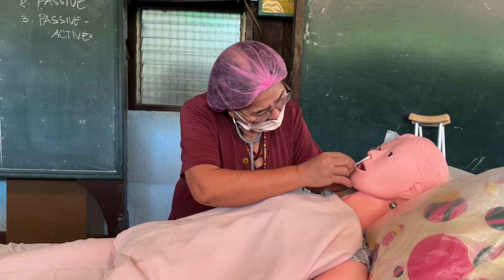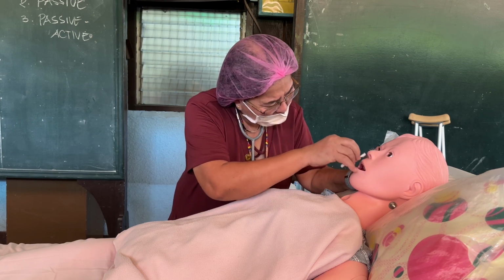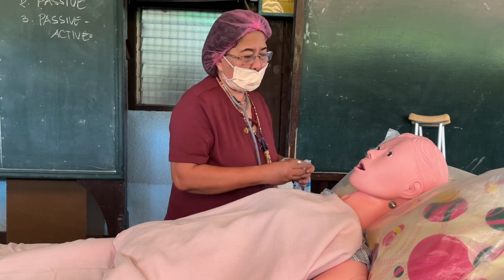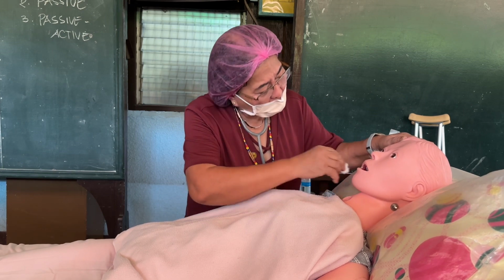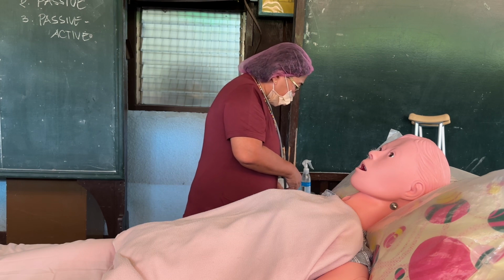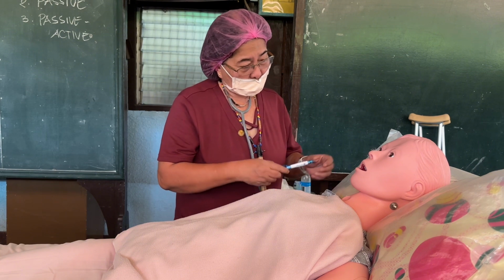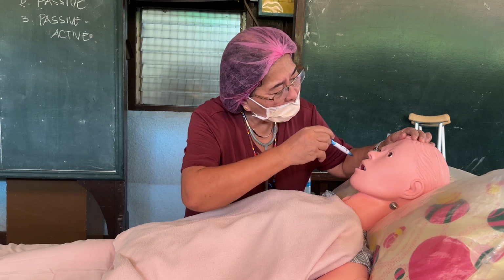Ma'am, are you feeling okay? Okay. So clean, and then you also clean the mouth. Moisten it. At the same time, check for any dental problems, abrasion, or bleeding. Check the nose also for any wounds or cracked skin.